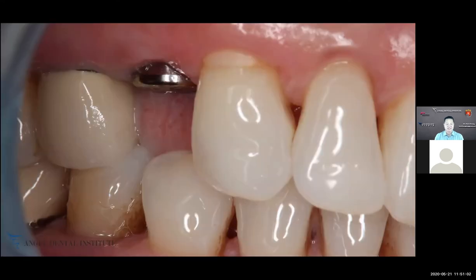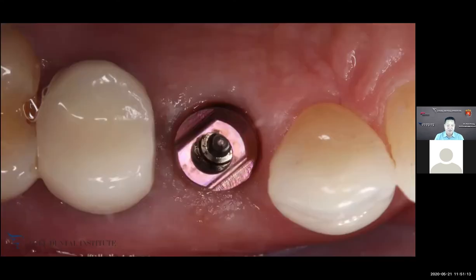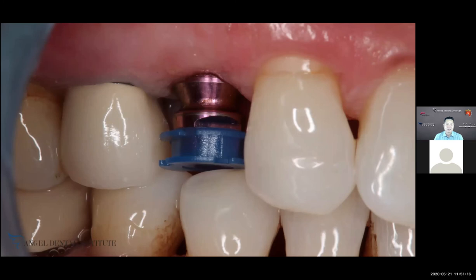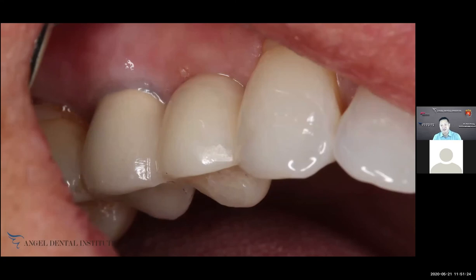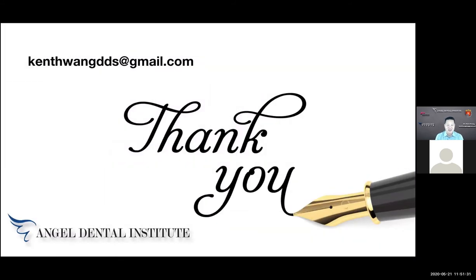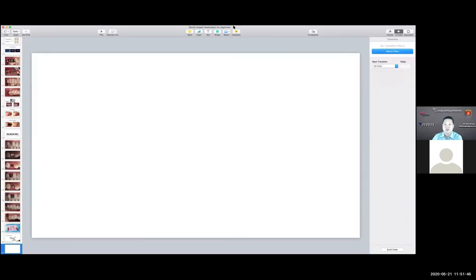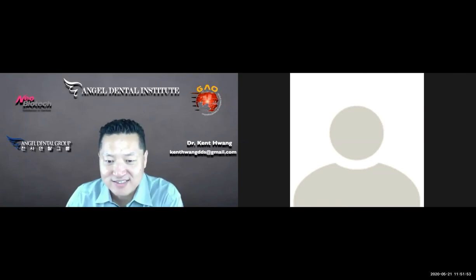Here's a case example of an upper premolar implant: the patient returns after placement, healing abutment tissues look great, we place the pick cap impression, take the impression, place the crown, and the tissue looks beautiful around it with the access hole barely visible. I know I went through that very fast and it might be confusing, but now let's open it up for questions.